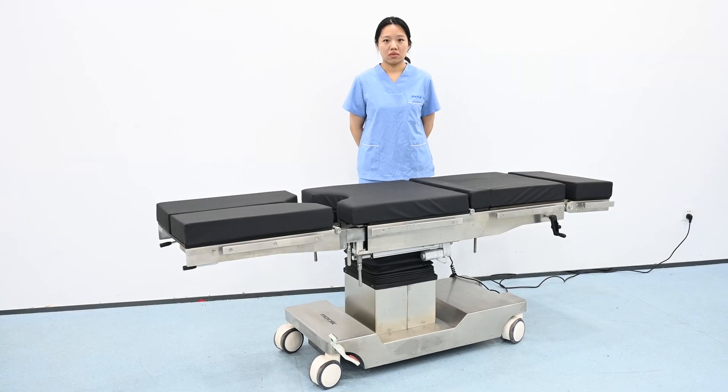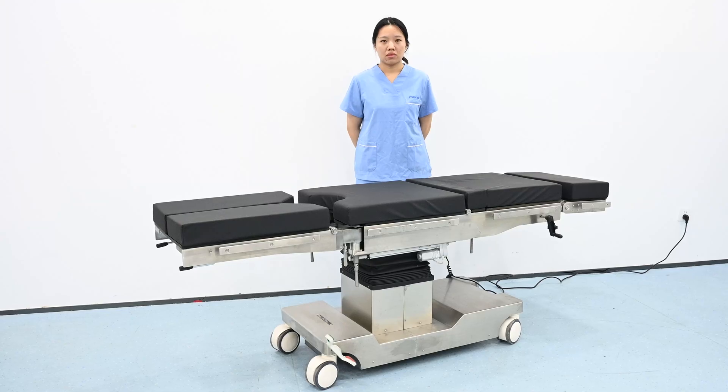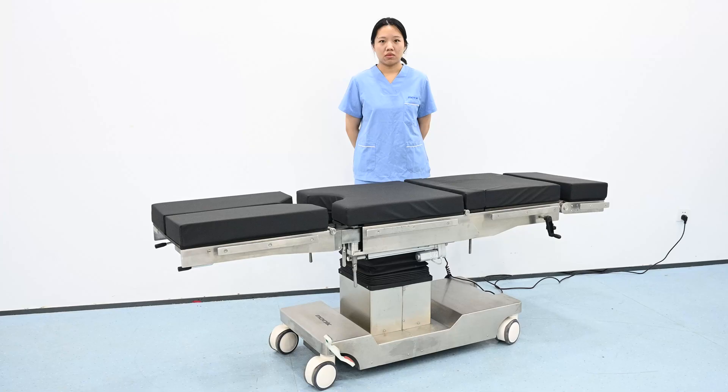Hello everyone, today we will show you the double layer arm plate used to set up the operating table for hip replacement or nephrectomy in a lateral position.